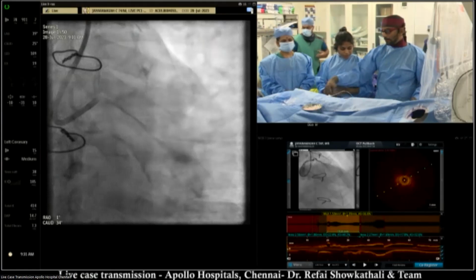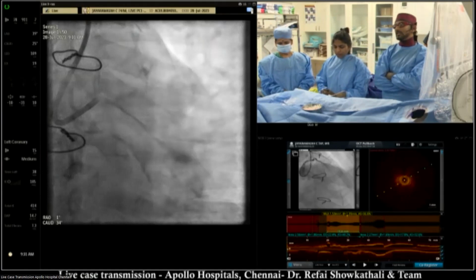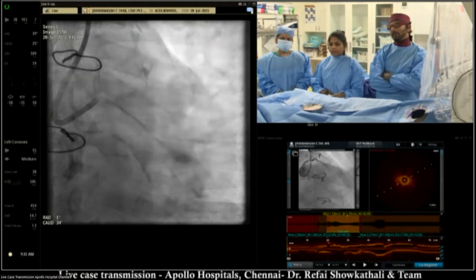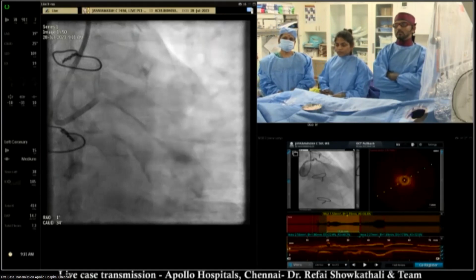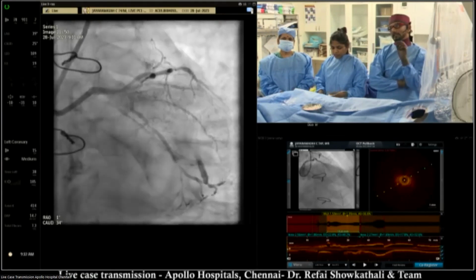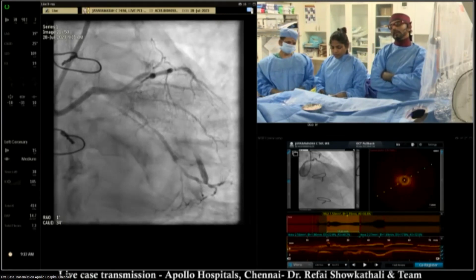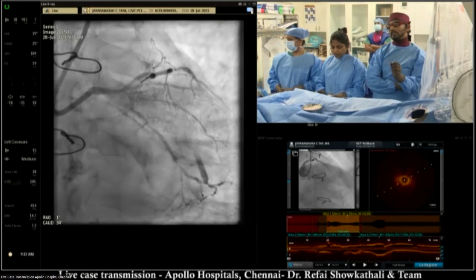I'm not entirely sure whether the LIMA went down very early on and he was just living on the LAD, and now the disease has progressed and he's presenting with symptoms, or whether the LIMA occlusion is very new. When I looked at the pictures, the LIMA is not occluded from the top. There is a little flow into the first 10 millimeters, and nothing after that. I'm not sure exactly, but the typical symptoms are only within the last few weeks.